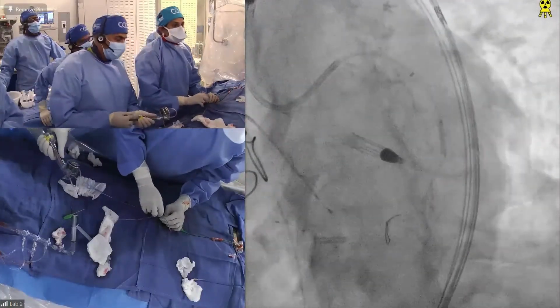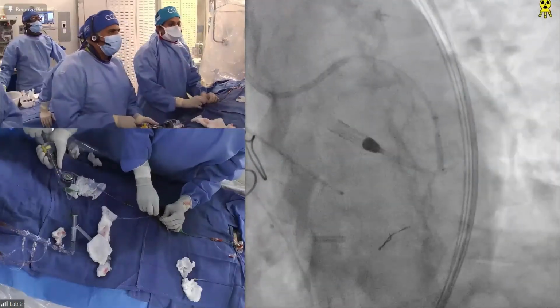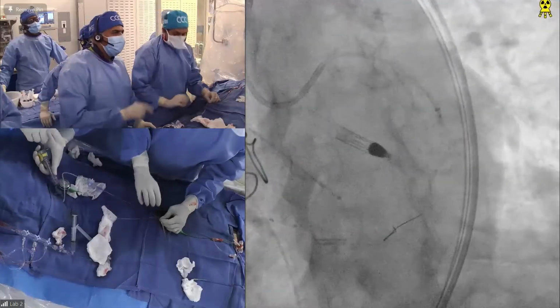More. Come back a little bit. Advanced, yeah. That's it there. Now deeper. That's it. Let's do that spot there. You want to do that spot? Or no? No, we did it. I think you got to come back a little bit with the. Get the mouth.